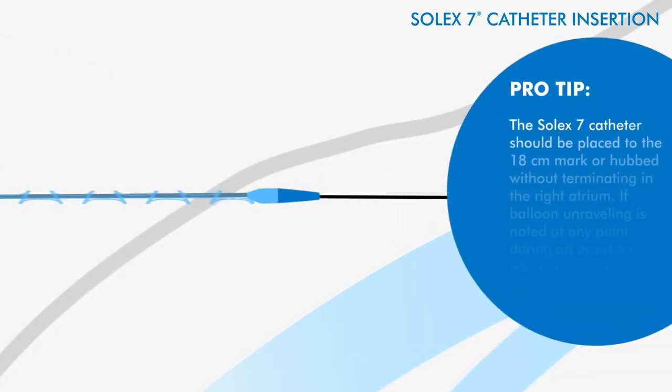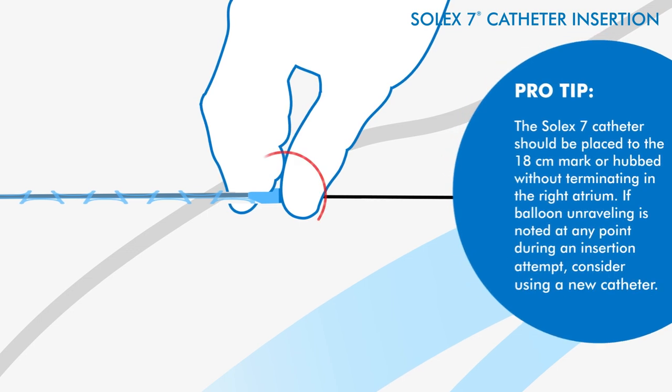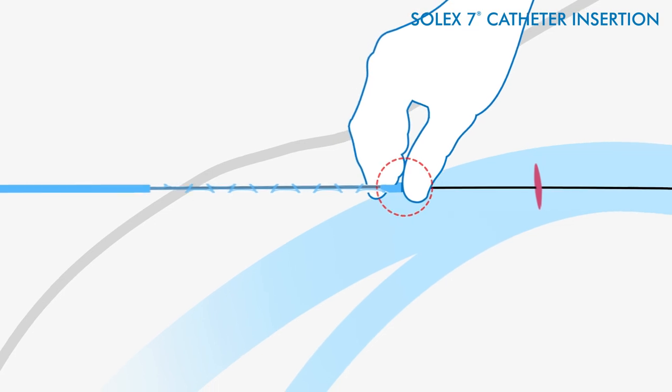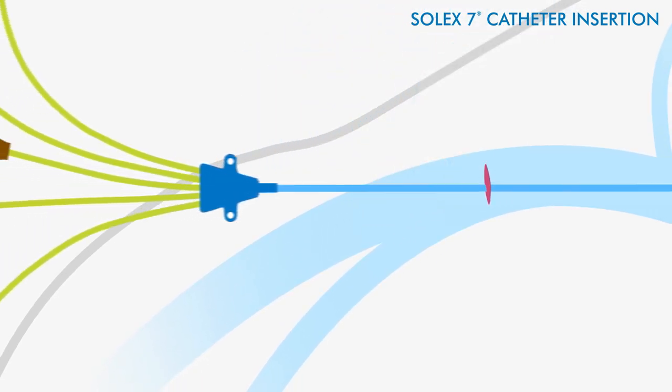To avoid direct handling of the balloons, grasp the catheter tip near the skin and advance the catheter over the wire. Then continue to advance the catheter over the guide wire while placing your fingers just proximal to the balloon.